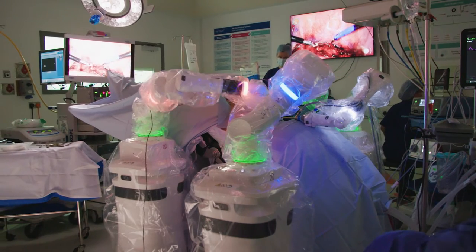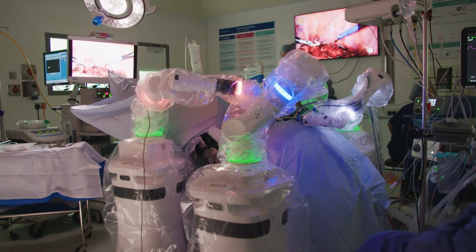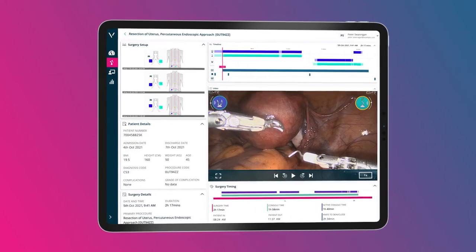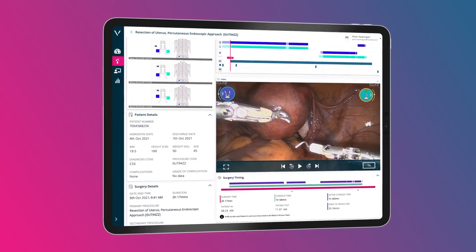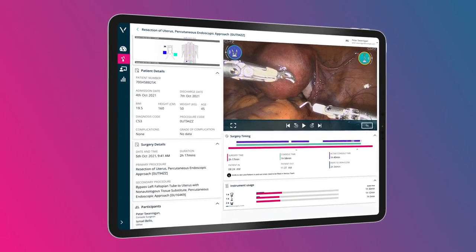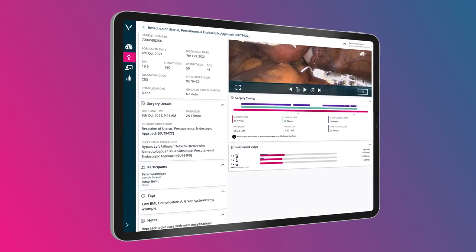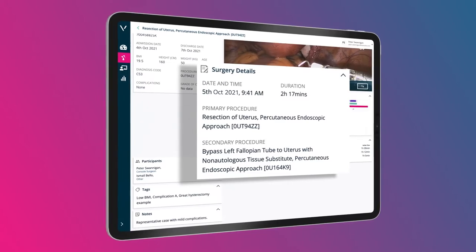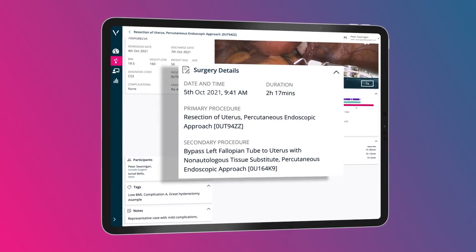Access all your key procedure and clinical statistics for every Versius case, making it easier than ever to track your usage through insightful metrics.